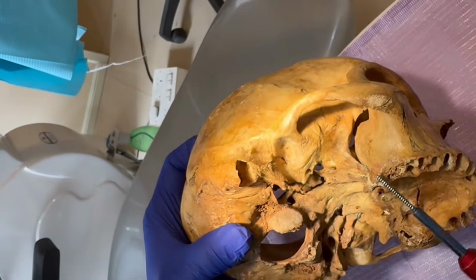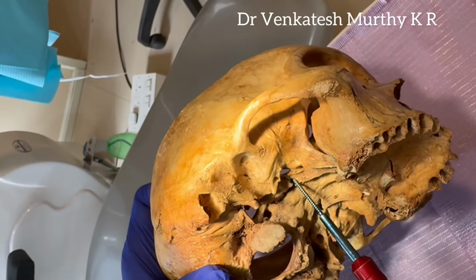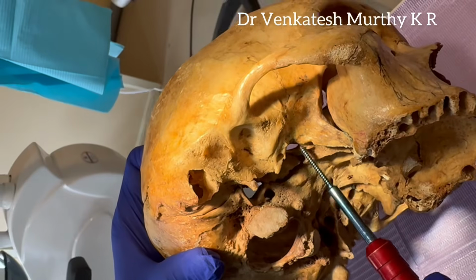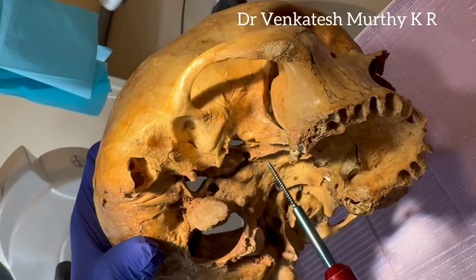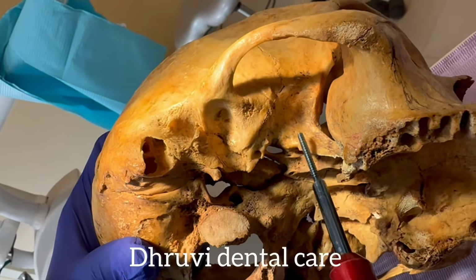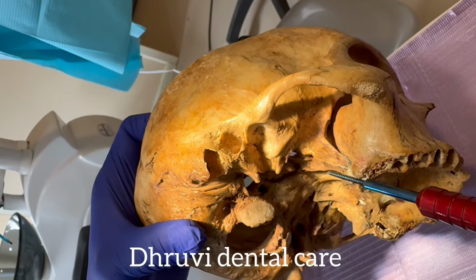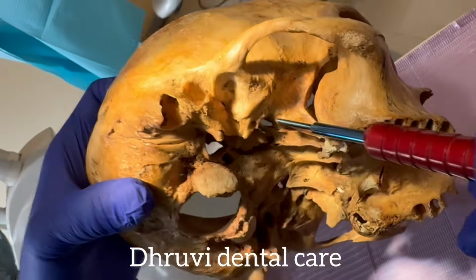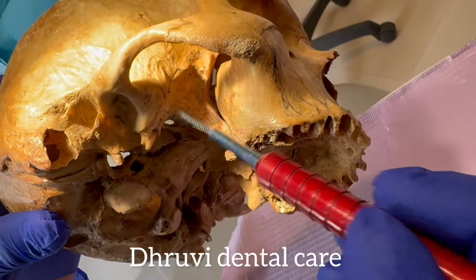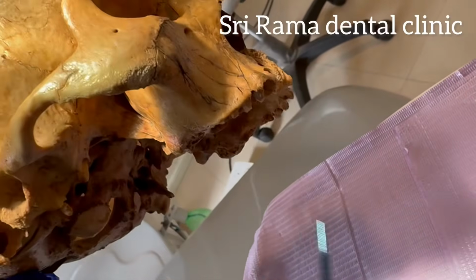Be careful, it should not be more than 40 mm length of the implant, because you will get the maxillary artery there. That is the internal maxillary artery, which is a branch of the carotid artery. It comes here in this region, more towards the lateral pterygoid plate, but our direction will be like this. Usually we won't touch that maxillary artery, but don't go beyond 40, I mean between 35 to 40. It usually emerges here. So the maxillary artery gives three branches, one branch to the maxilla, one branch to the temporal fossa, and another one to the mandible.